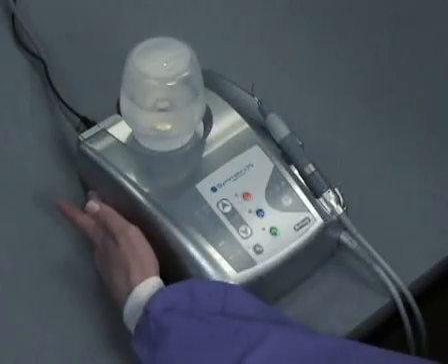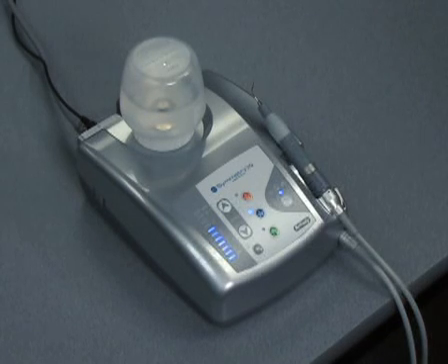When you power up the control unit for the next procedure, the system will reactivate in the same configuration as when it was shut down.